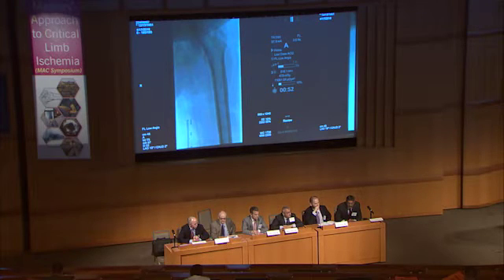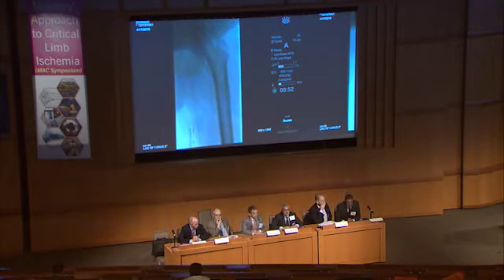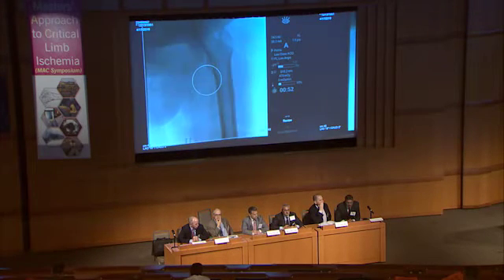I'm going to do it. Thomas, I'm going to put a wire right now. I actually took out the wire; I shouldn't have taken it out. I'm going to put a wire here in the profunda, and we put a balloon in there, and we occlude the profunda and take a picture. I think it makes sense. Sure, because I get Bruce's point that the SFA was occluded, so we already know that some of these fistulas are coming. Give me that. Can I get an 018?